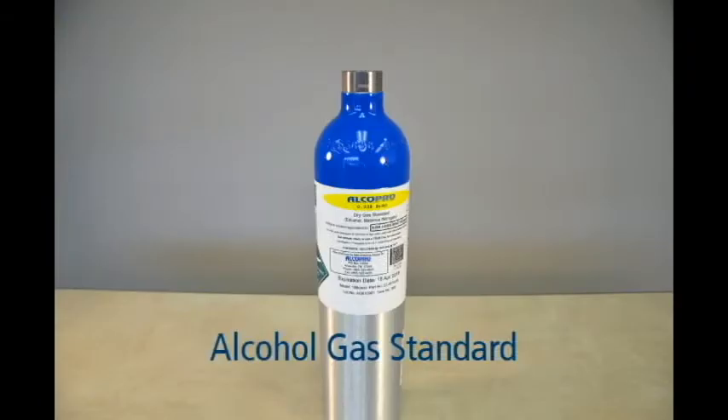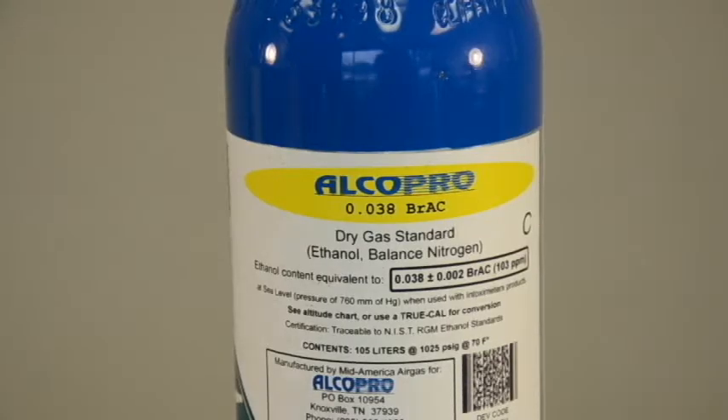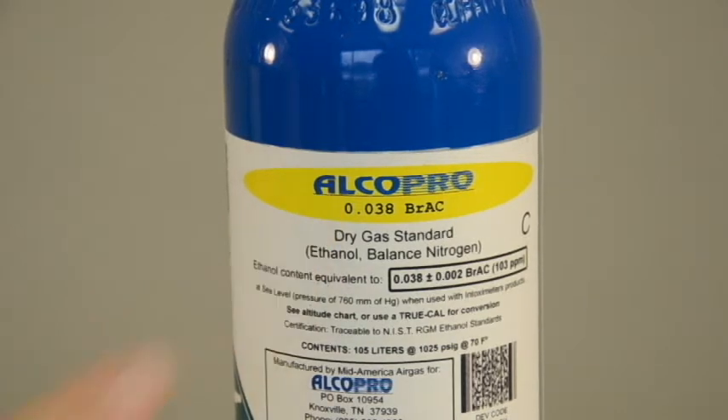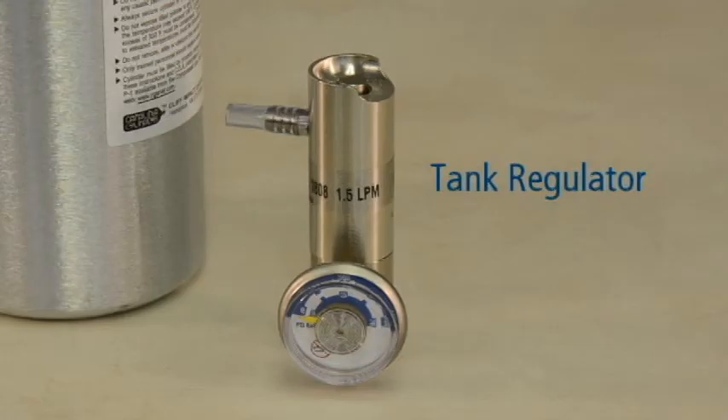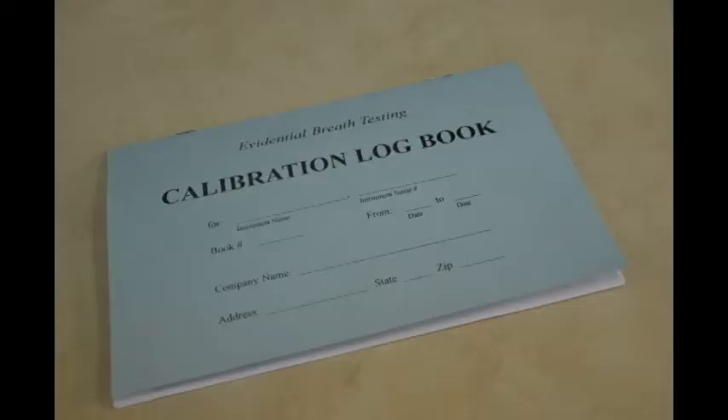You will need an alcohol gas standard. We will be using a dry gas standard with an ethanol content of .038 BrAC at sea level. The dry gas standard concentration can be located on the gas tank label. You will also need a tank regulator to attach to your dry gas tank. It is a good idea to keep a logbook of accuracy checks and calibrations performed on your device.